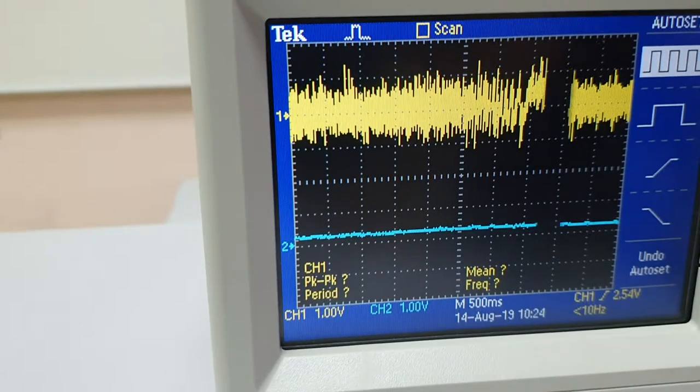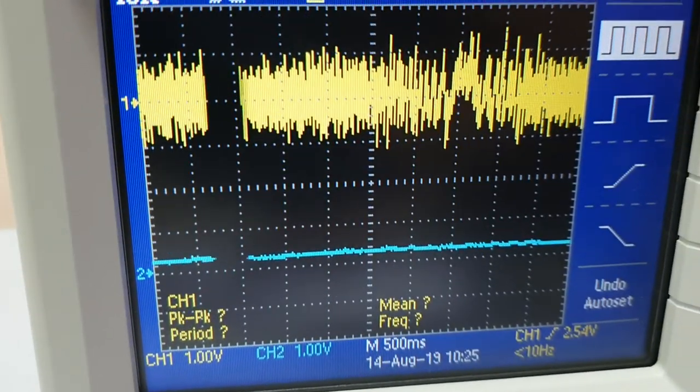As you can see, the graph is always spiking up. Then we go to the second task, which is the isotonic contraction measurement. The subject needs to lift the dumbbell to 90 degrees for about two seconds and put it down repeatedly for three times.